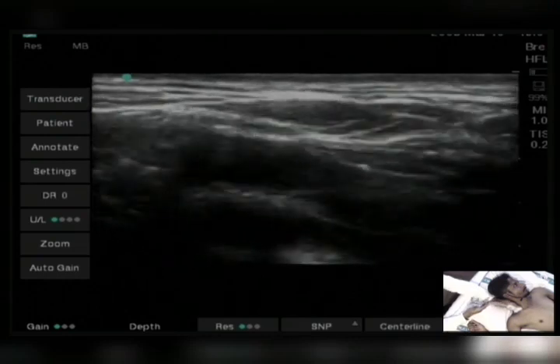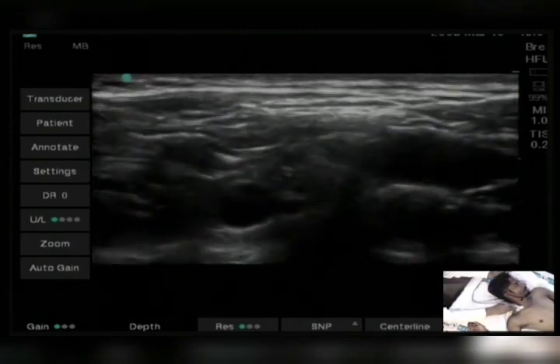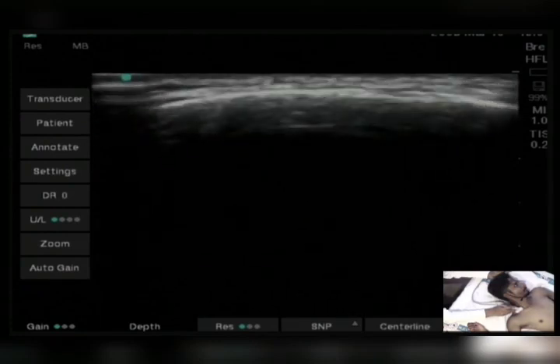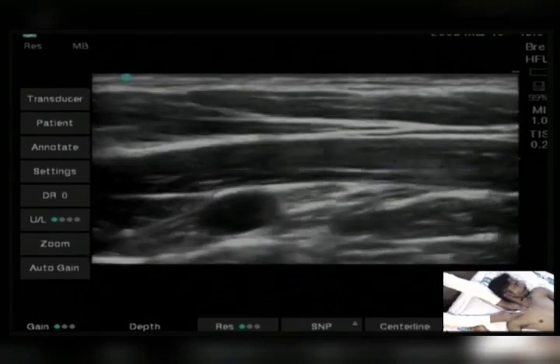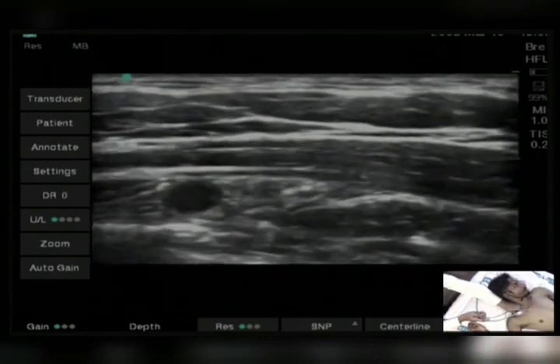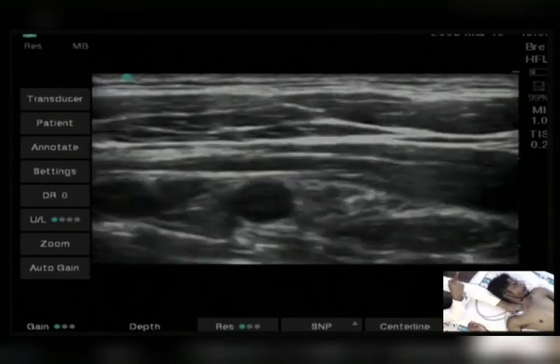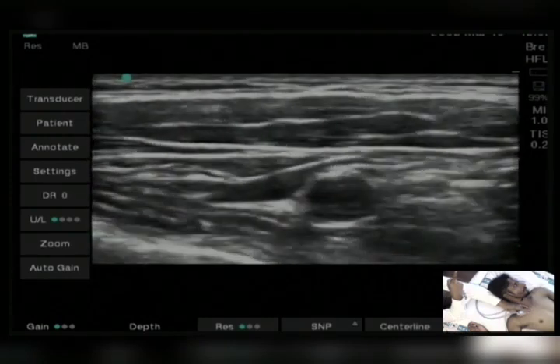See, this is supraclavicular. Okay. You can see here as well. Picture is better in this. And when I go downward, this is the clavicle and this is the costoclavicular space. We are entering over the costoclavicular space and try to direct my probe towards the cephalad. Okay, this is the subclavian artery over here, and somewhere you will find this vein, the subclavian vein, where the cephalic vein is entering.